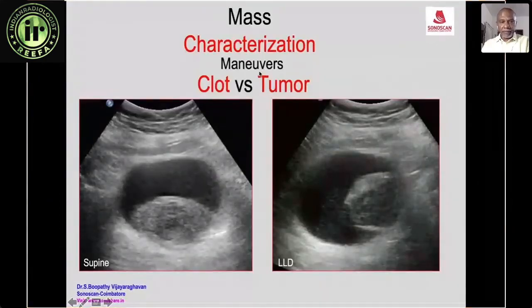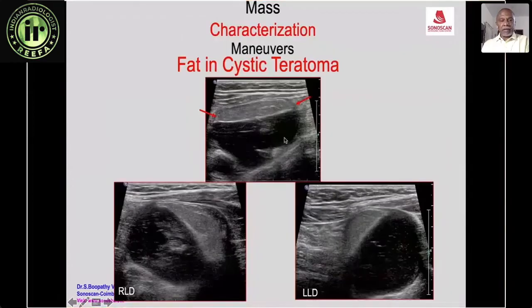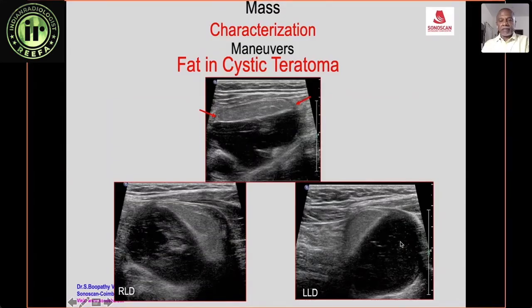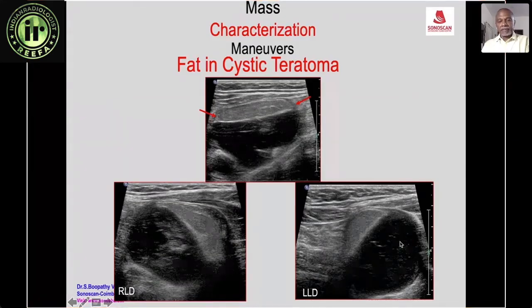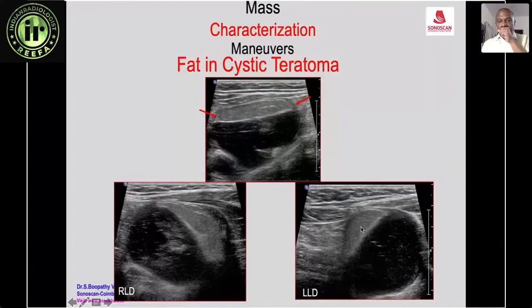Positional maneuvers help characterize a mass. In a patient with hematuria, a mass that shifts with position change is a clot. In a woman with a lower abdominal mass, the solid-appearing mass anteriorly also shifts with position change — only fat floats on fluid, so this is fat, bringing the diagnosis to cystic teratoma.